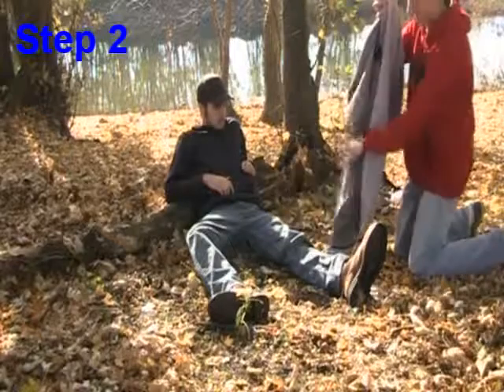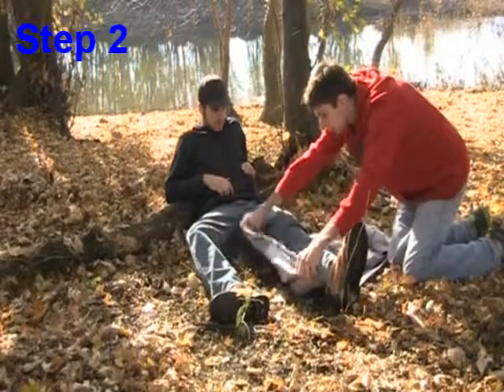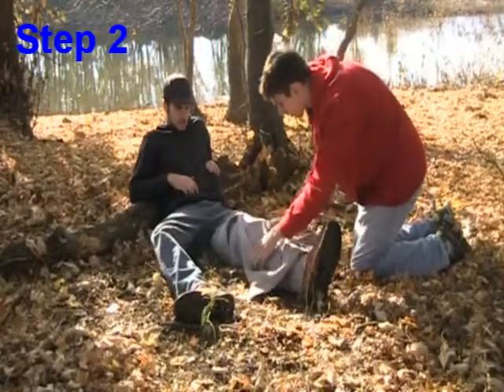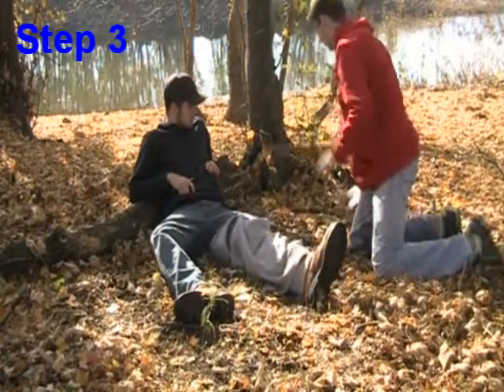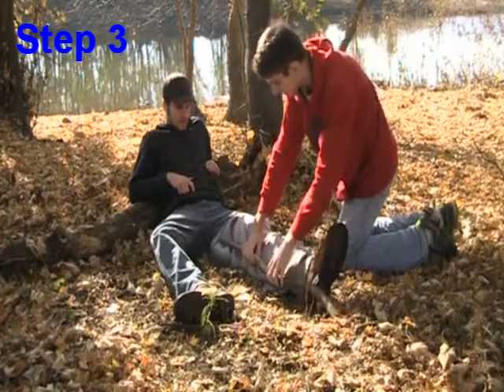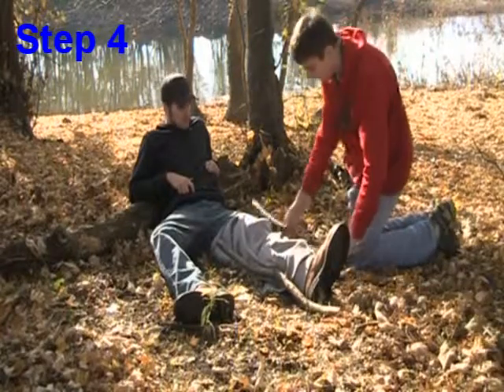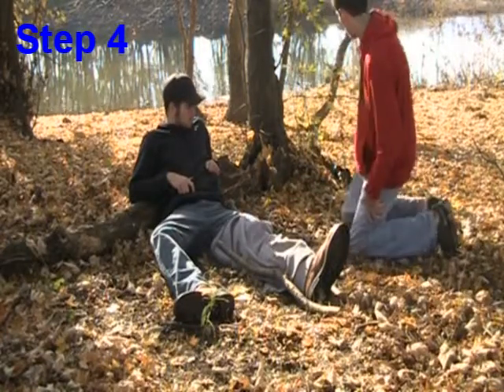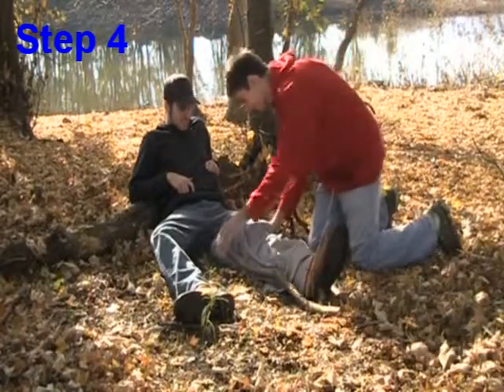Next, we wrapped the leg with a sweatshirt to protect it. If you do not have a sweatshirt, any extra material would do. If you do not have anything to wrap the leg with, this step is not necessary. Then, place the medium stick against the inside of the injured leg. The next stick should be the longest stick, and place it along the outside of the leg. All sticks can be replaced with any other rigid object, such as, but not limited to, a hiking pole, an unloaded rifle or shotgun, umbrellas, etc.